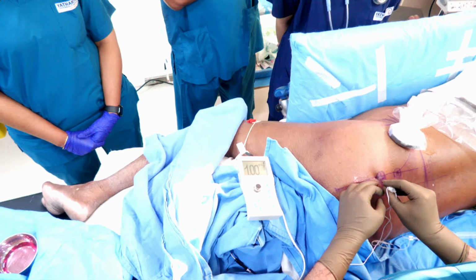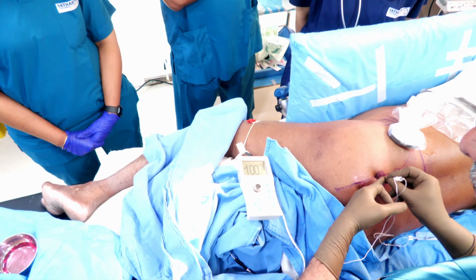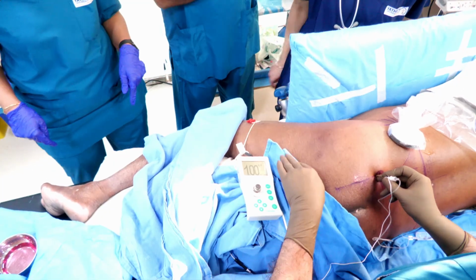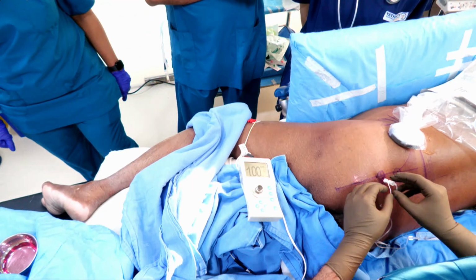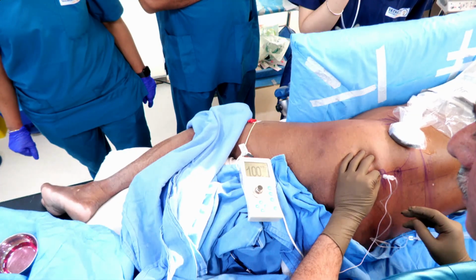I think this would be beyond this. I should not go beyond this. So I've held it 2 centimeters after hitting the bone. Okay. Can you see the contractions? Yes, we can appreciate. So what I did was I just slid the needle just beyond when I had hit the bone, probably a part of the greater sciatic notch.